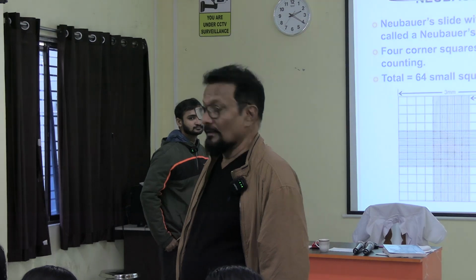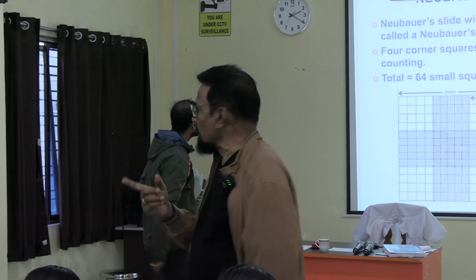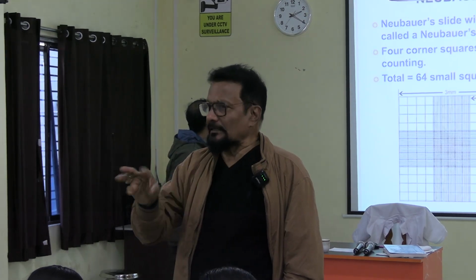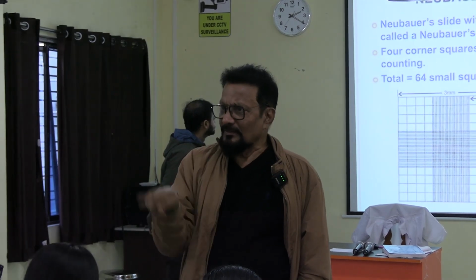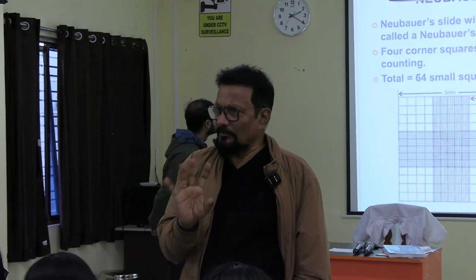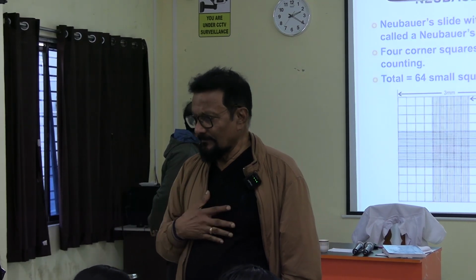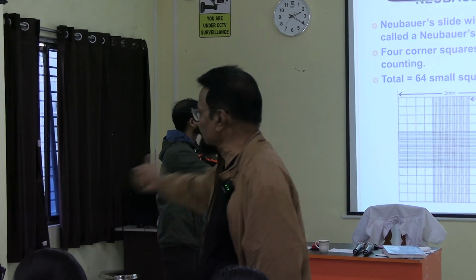So, everybody will be asked. I will be asking you in WBC, I am telling you, so be prepared for that. I may tell you in 5 such squares there is a total number of this, or some others, in 3 small divisions there are a number of WBCs. This much, what will be the value? The dilution factor is this. I think everybody will be able to answer. Good. Next.